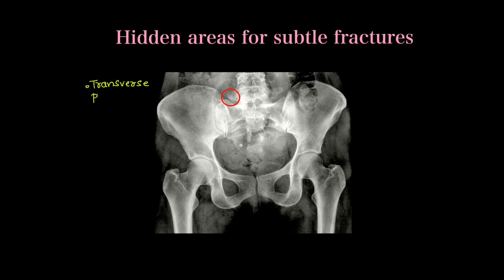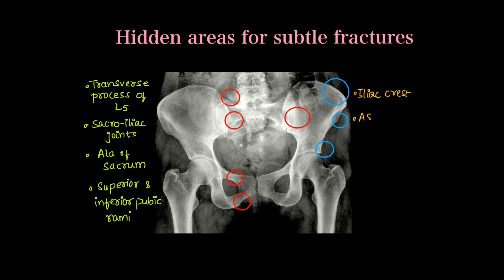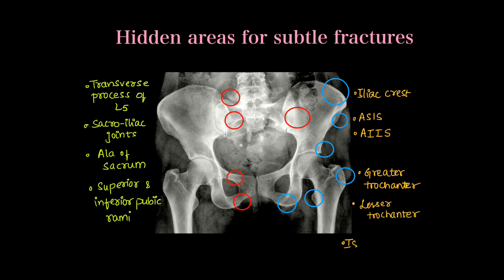Lastly, we will see some hidden areas on AP x-ray of the hip where subtle fractures can be missed. These include the transverse processes of L5, bilateral sacroiliac joints, the ala of the sacrum, the superior and inferior pubic rami as sites for stress fractures, the iliac crest, the anterior superior iliac spine, the greater trochanter as another stress fracture site, the lesser trochanter where fractures can be missed, and the ischial tuberosity.